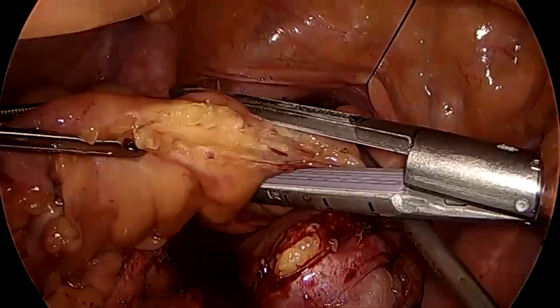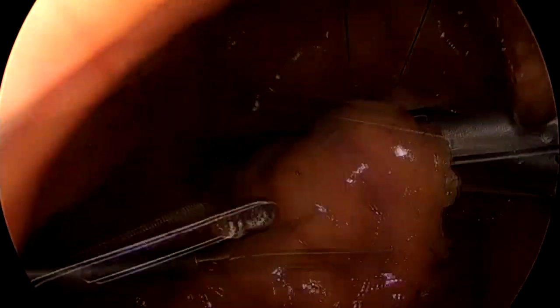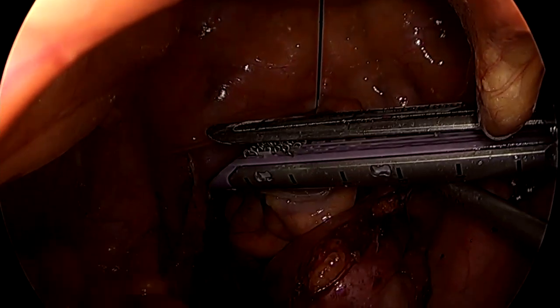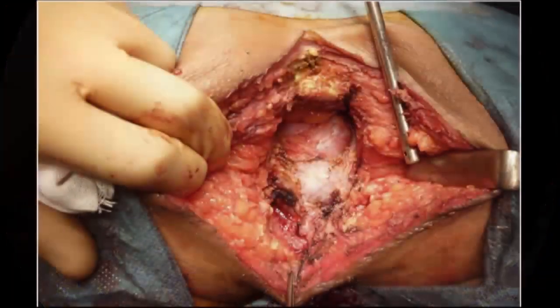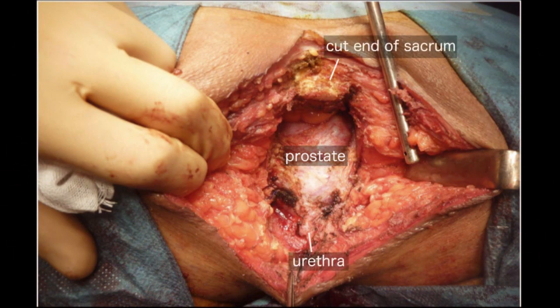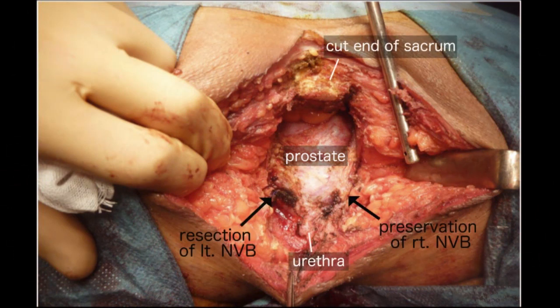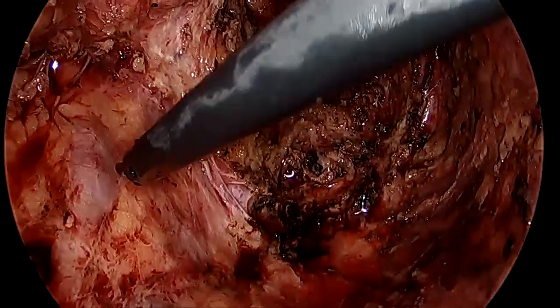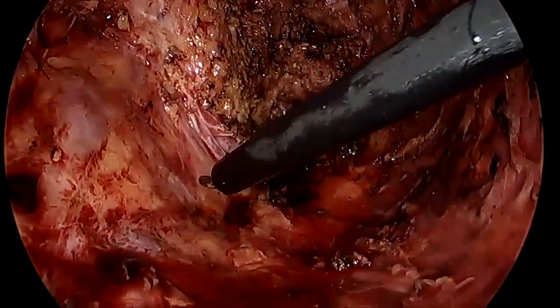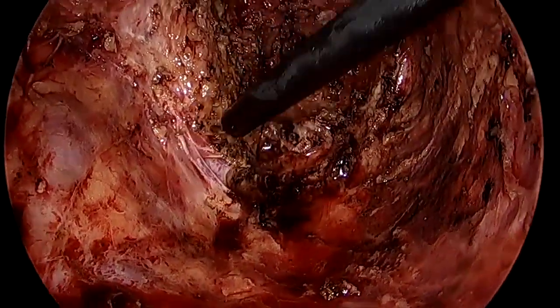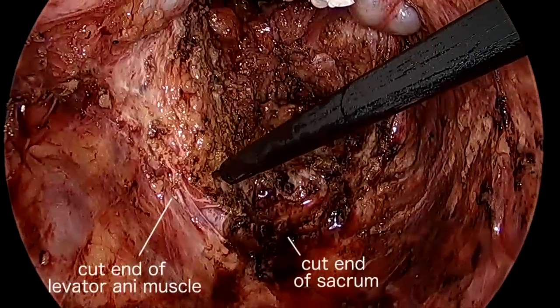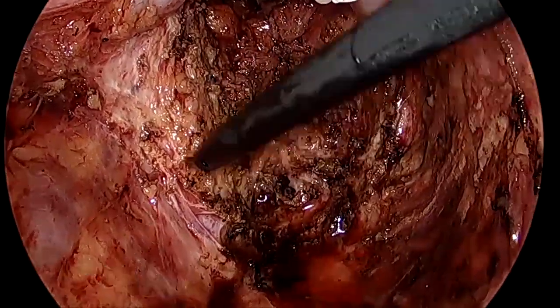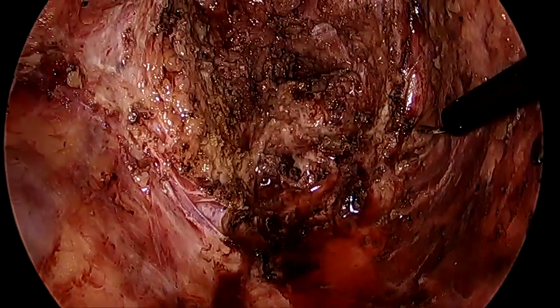Afterwards, the patient's body position was converted to the jackknife position. Next, we proceeded with the transperineal approach. The sacrectomy was performed at the level of S5. The left side neurovascular bundle was resected under direct vision. This is a final view from the transabdominal side. The pelvic autonomic nerves, the cut end of the sacrum, and the levator ani muscle were seen.